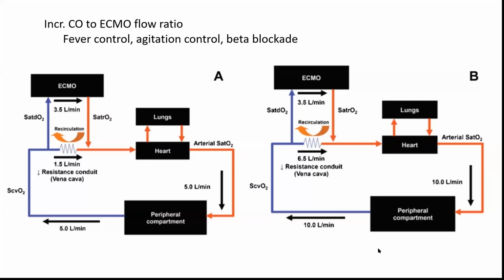Okay, so I hear some difference in the flow. So here, this is the cardiac output, just to give you some context. Cardiac output here, and this is the cardiac output here. So it's actually bypassing the ECMO, the oxygenator, right? There's more flow across. Good. So it's bypassing the oxygenator, probably because of that increased cardiac output. Good. We aren't able to have that appropriate suction from the venous blood and then reinfuse it as oxygenated blood. So we're shunting through more deoxygenated blood into the circulation.